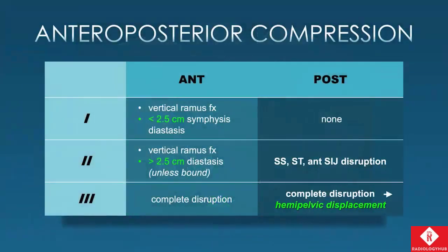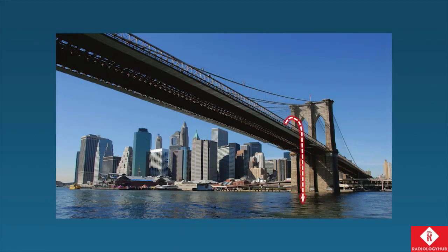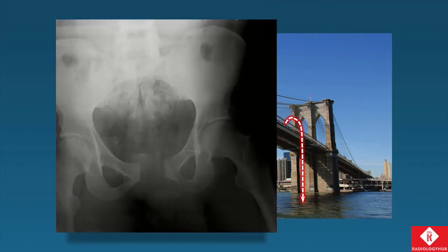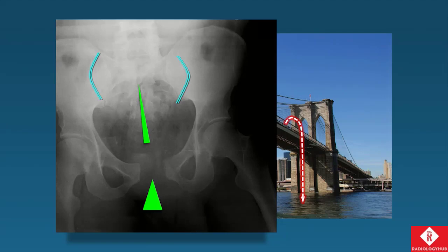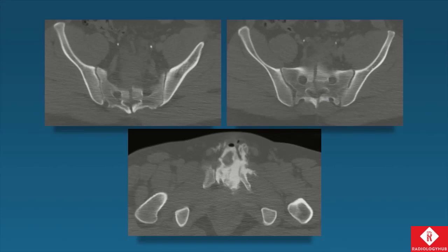In review of APC injuries: type 1 is limited to the anterior pelvis only — a stable situation. Type 2 adds pelvic floor ligaments and anterior SI joint disruption. Type 3 adds the posterior SI joint and hemipelvic displacement. Here's a case of somebody who jumped off the Brooklyn Bridge into the East River feet first — they did not keep their feet close together and blew open their pelvis, sustaining perineal injuries as well. We can see anterior SI joint widening, but instead of disrupting the SI joints, we have a vertical fracture going straight through the sacrum — an unusual but devastating injury.